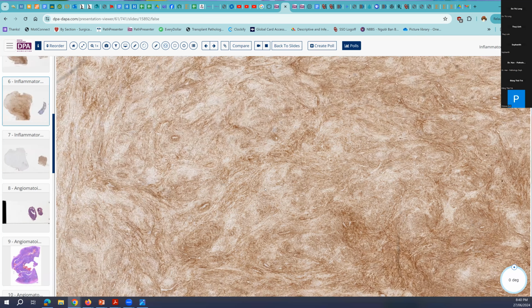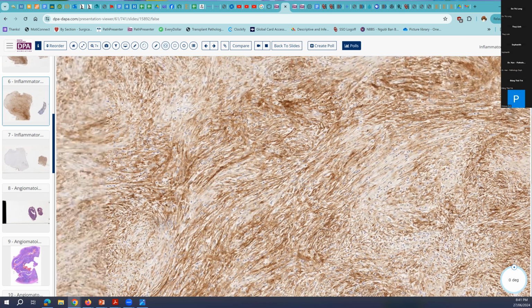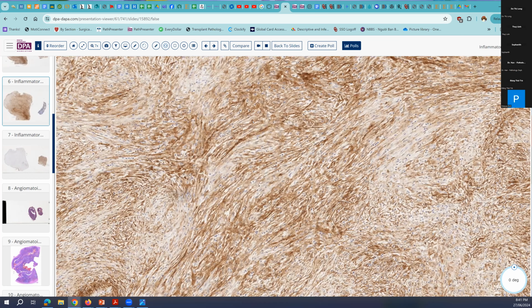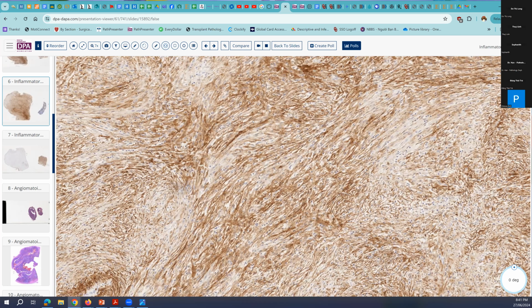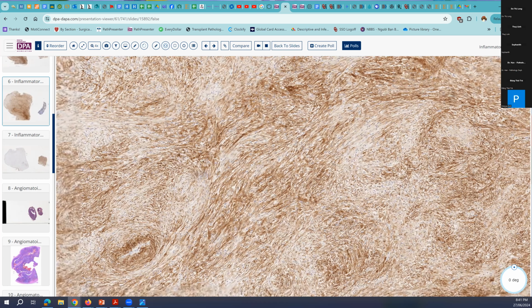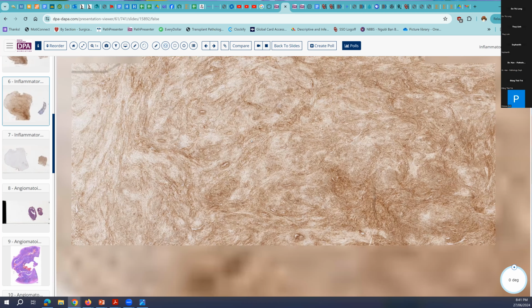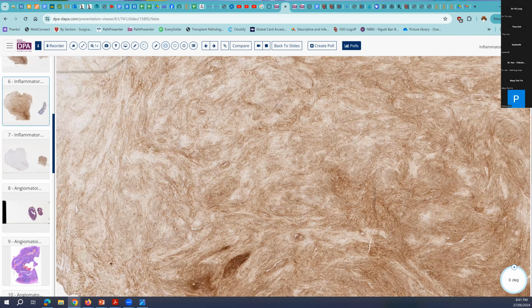And this, of course, would have made us go, well, maybe endometrial stromal sarcoma, because here it is CD10 positive. However, I believe this tumor turned out to be ALK positive, and it was negative for the JAZF1-SUZ12 fusion gene. So we did not think that this was an endometrial stromal sarcoma. But it's an interesting differential in a female patient. You do want to make sure that you're not dealing with one of those other neoplasms that could beset you.